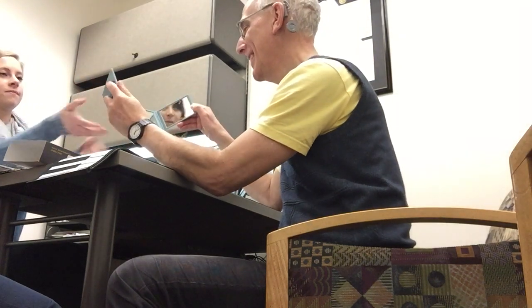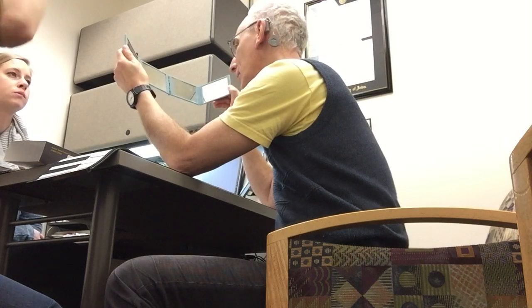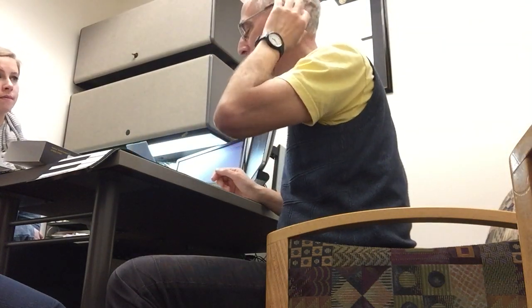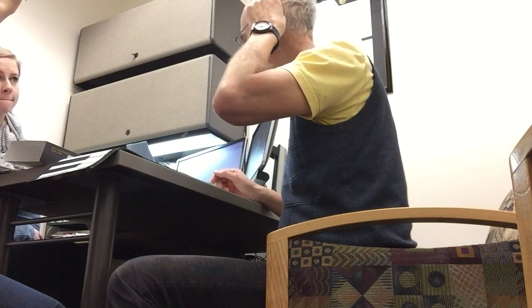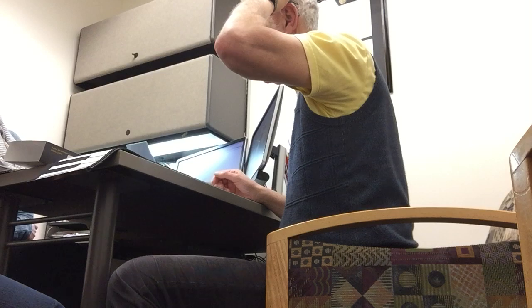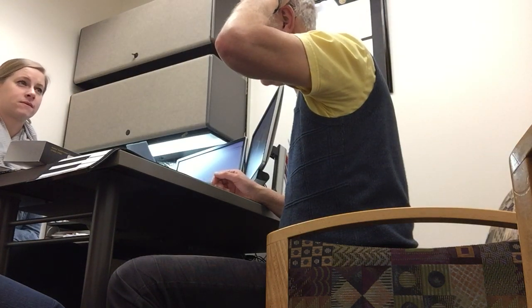Do you see the coil kind of hanging there? So this part faces outward, and the other side faces your head, your scalp. So the smooth part is towards the scalp. Exactly. And without trying to make it fall off, can you find where your magnet is? There it is. And there's noise. Perfect. The little chipmunks are in there. Great. You feel okay with doing that? I do.